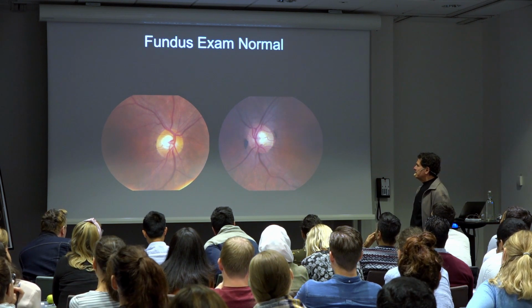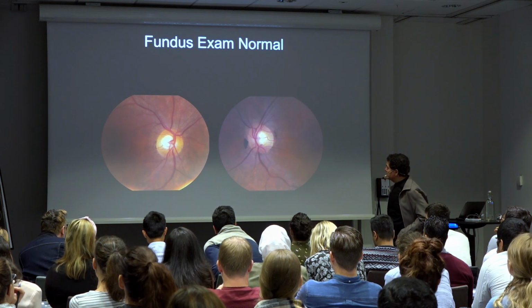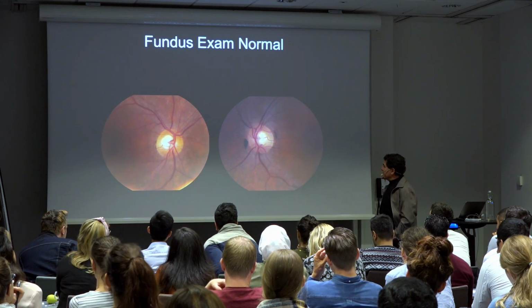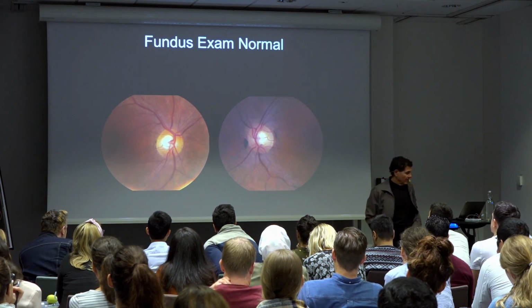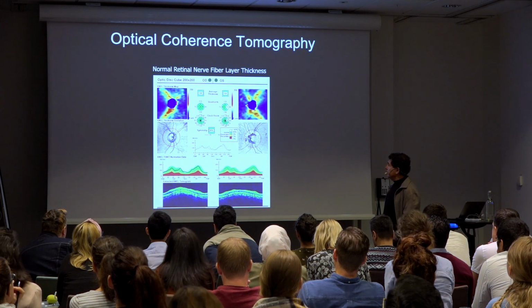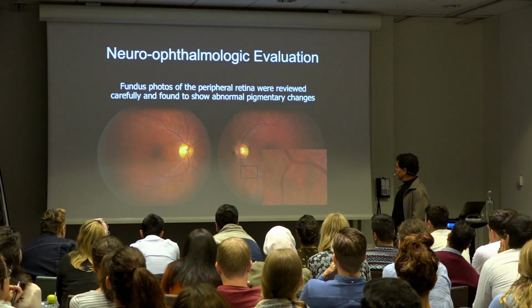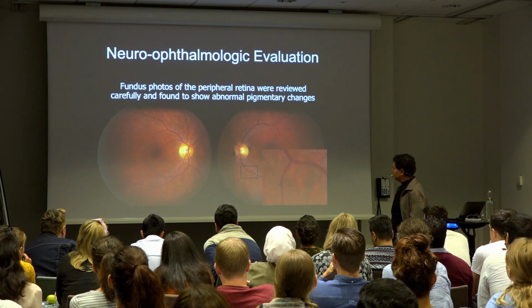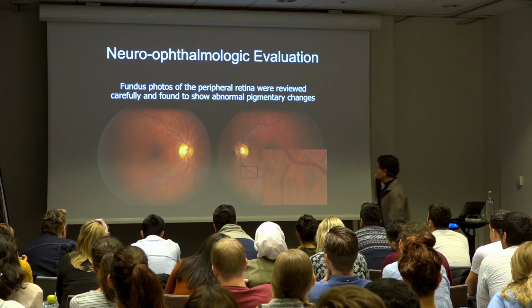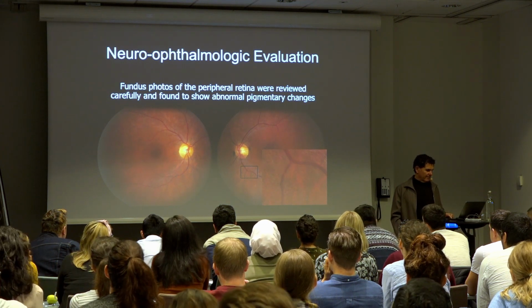This view of the fundus didn't look that abnormal when people first saw this woman. There's a sign of that. So some pigmentation there. So peripapillary pigmentary changes. Nerve fiber layer looked completely normal. Agreed? Yeah. Magnifying the fundus, is there any abnormality or not? Not that obvious. There's a little bit of pigmentary change, but nothing that really gets your attention that much.